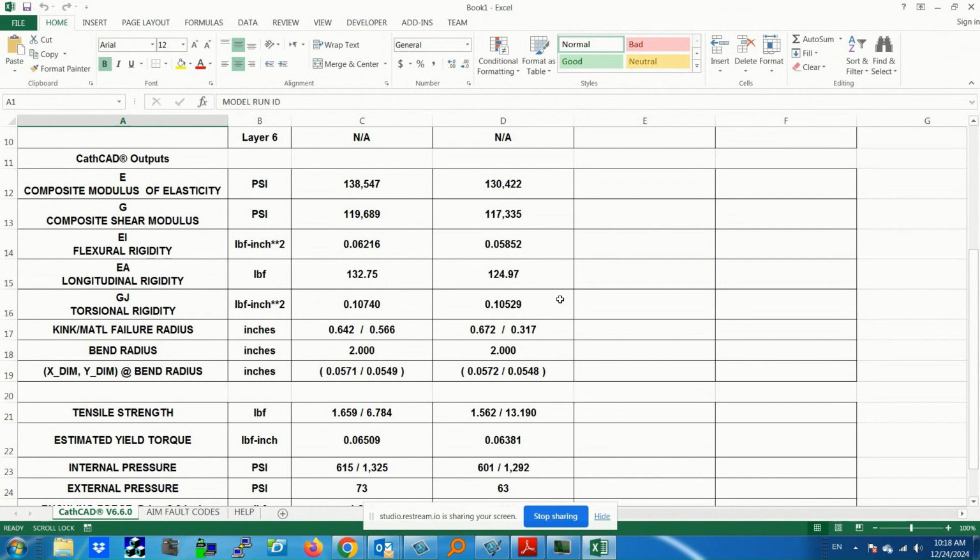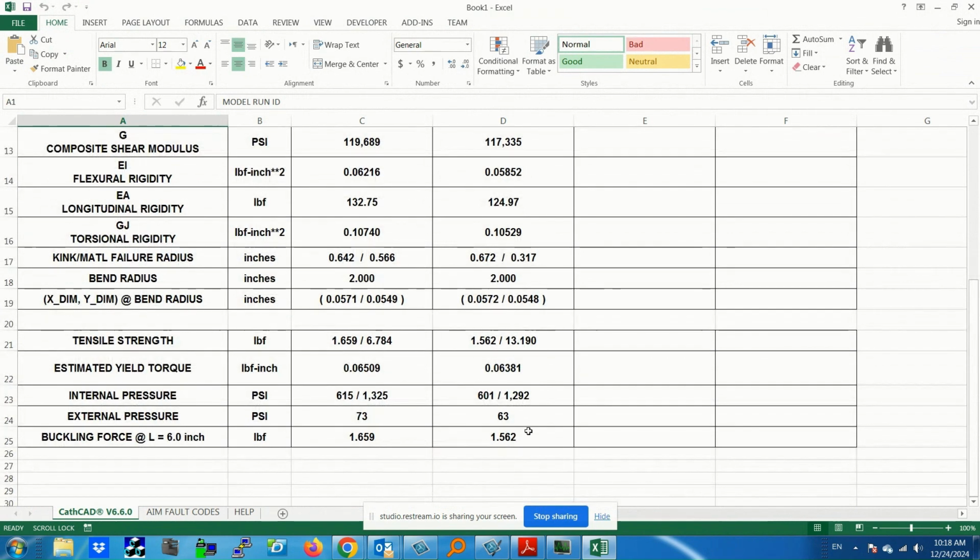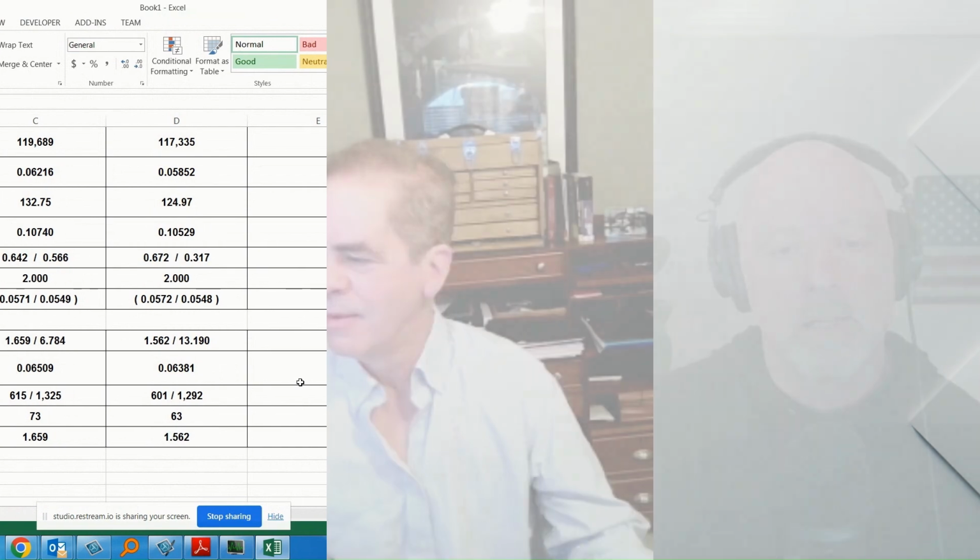Right. And then we have our 2 different kink radius here and our tensile strength. So again, very, very simple to look at these designs and make a judgment. If you had these 2 catheters side by side, a human being would probably be hard pressed to tell the difference between them. That would be the conclusion. But again, you can go along that line and make adjustments really quickly.